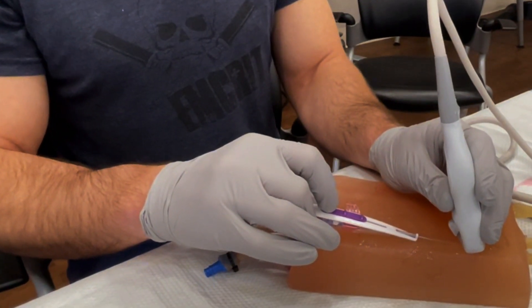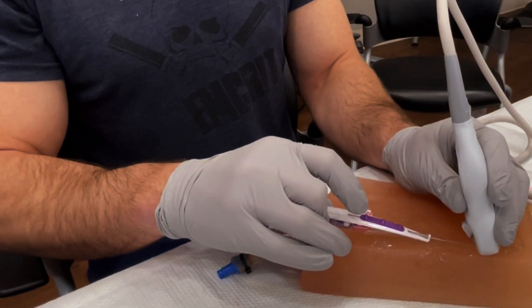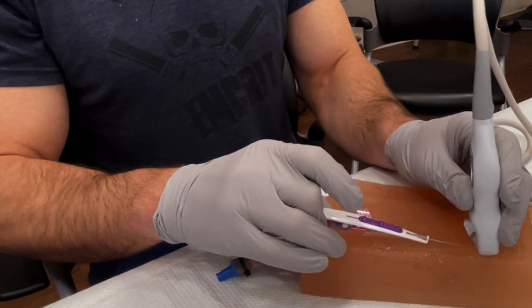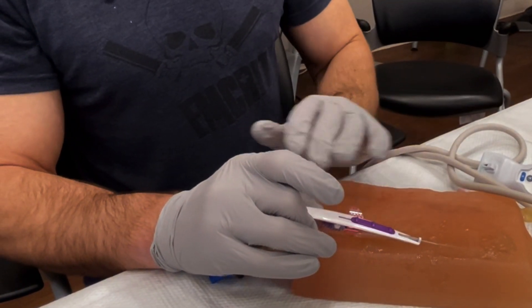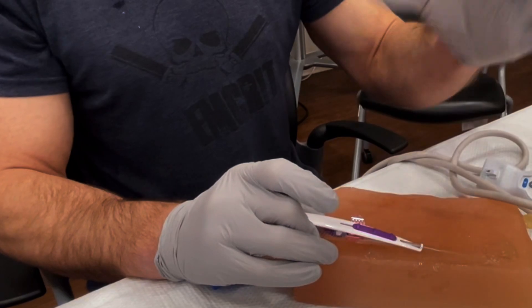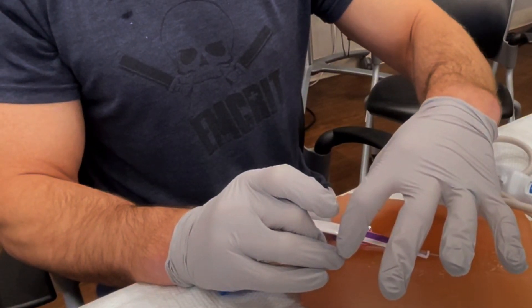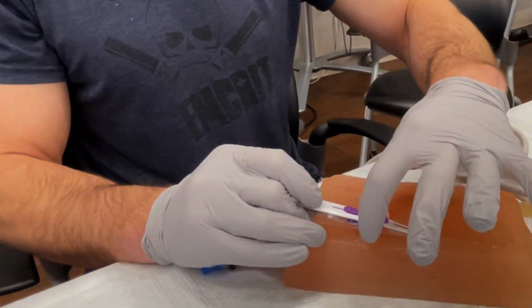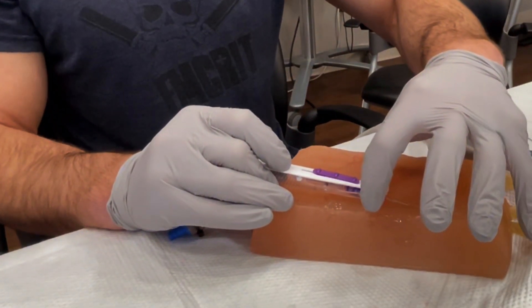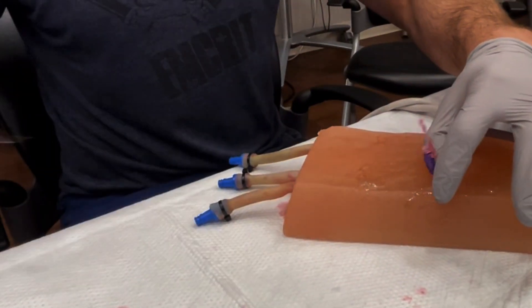My finger comes to the purple slide and I slide it forward until I feel a click. Once I have that click, the wire is in place. Now I can put down my ultrasound — this hand holds the needle or catheter in place and I'm not going to move it. With two fingers I grab the two butterfly connectors and push them forward until they slide into place. Then I can pull the needle out the back.